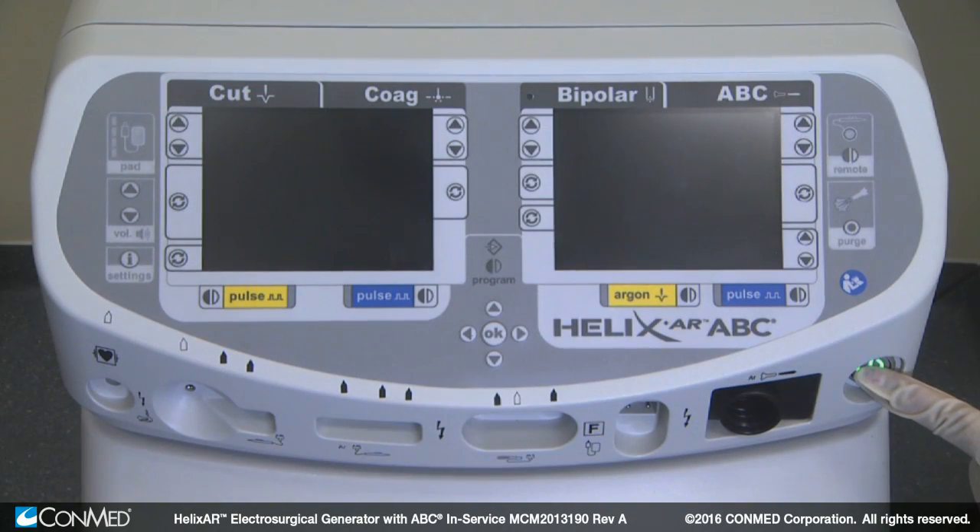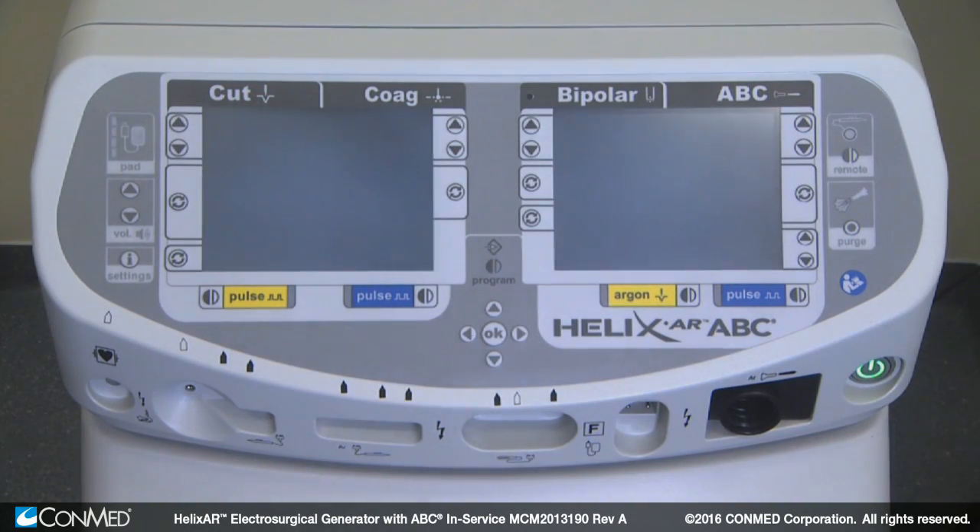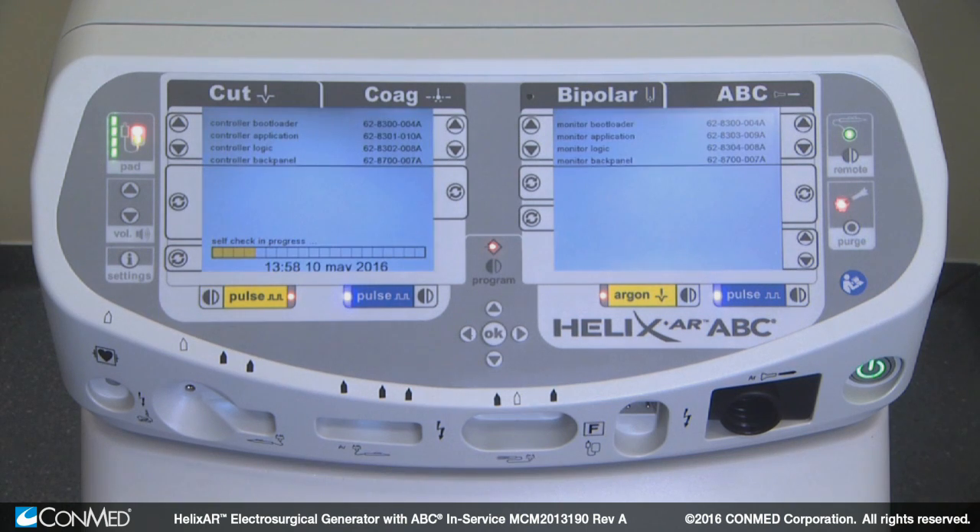Next to that is the standby switch, which starts up the generator. You'll see the screens come to life.